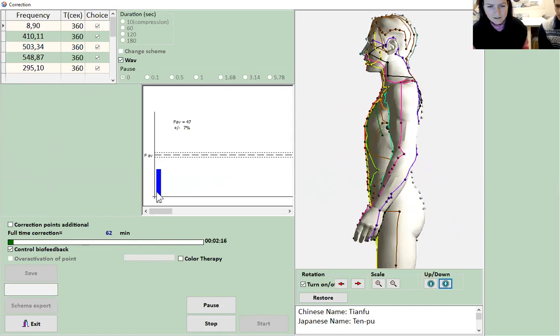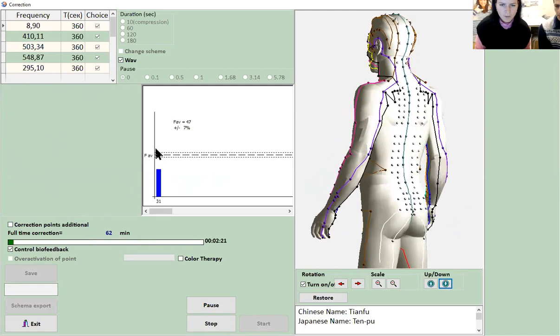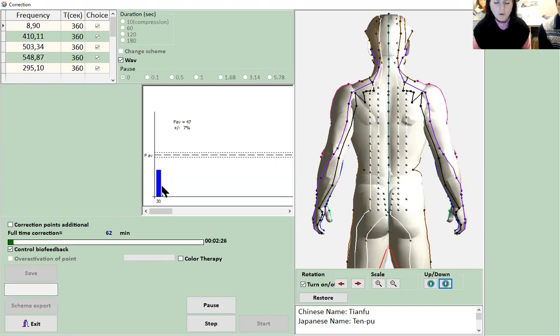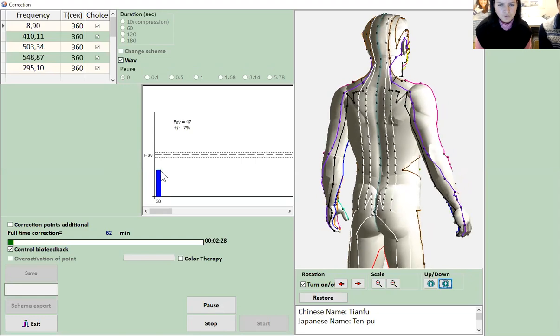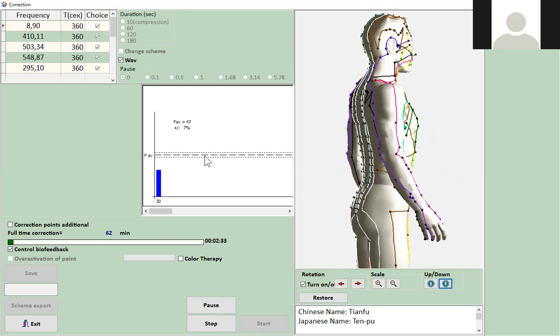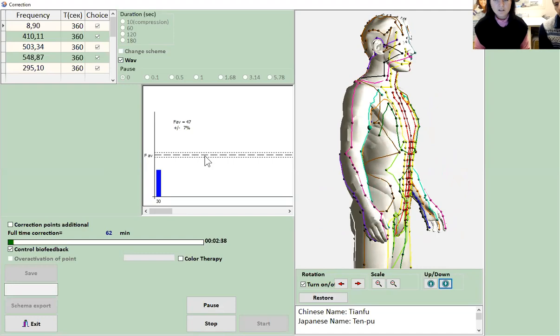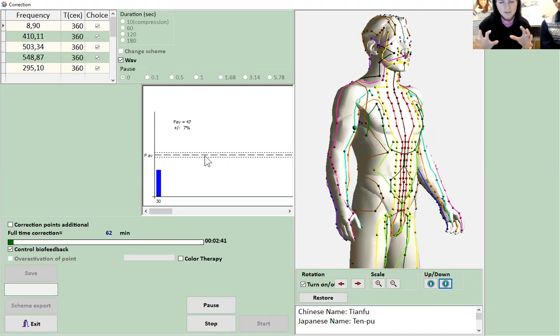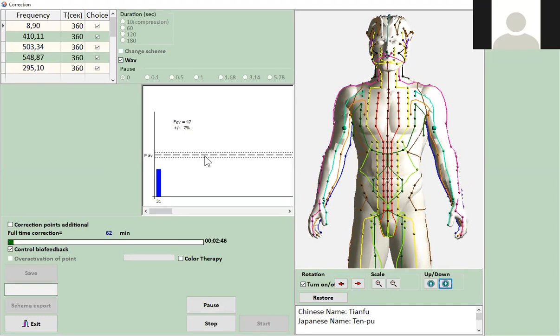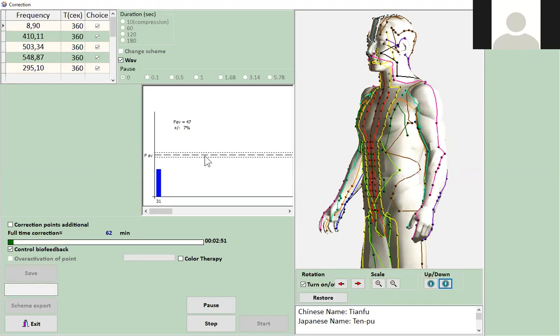And this line, the blue one, should be changing. It should be going up, up, up all the time. The purpose of the treatment is to get onto this line. And what if it doesn't get to that line? Sometimes it doesn't. That means the body is still, you know, fighting back. Okay, so then you discontinue the treatment and let the person rest and come back another day?